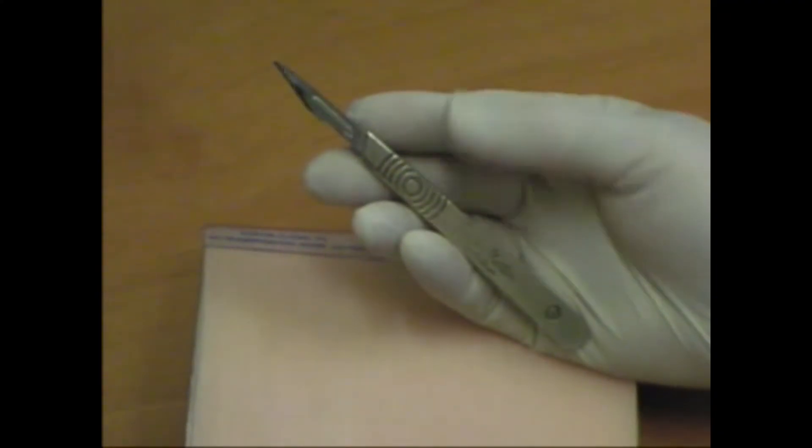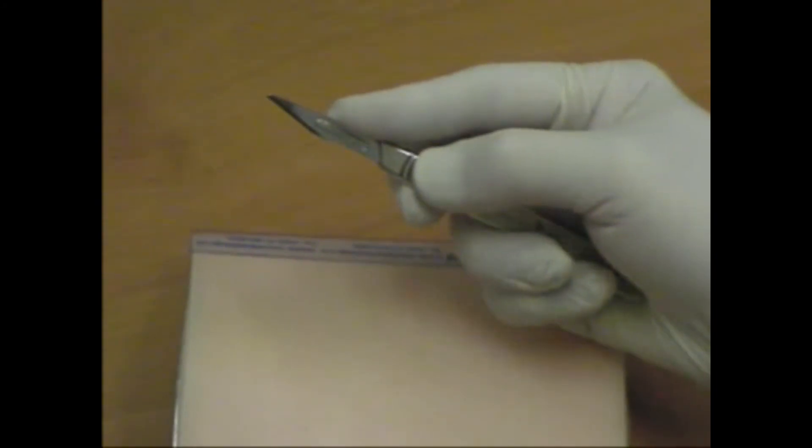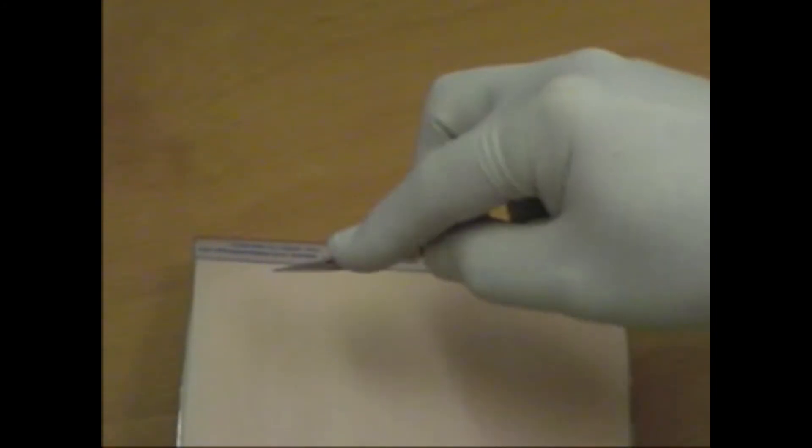The scalpel is held between the middle finger and thumb, placing the index finger close to the blade, applying downwards pressure, and the other fingers steady the handle. When cutting the skin, a single positive stroke should be performed.